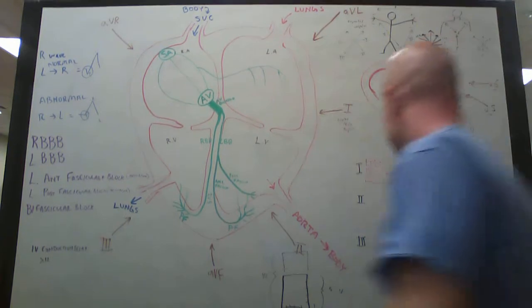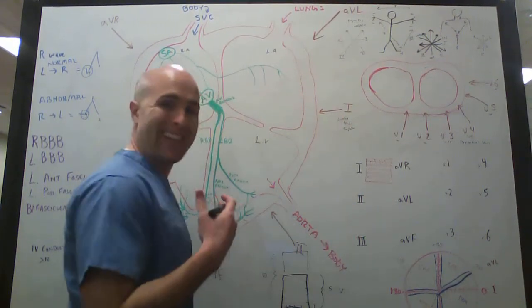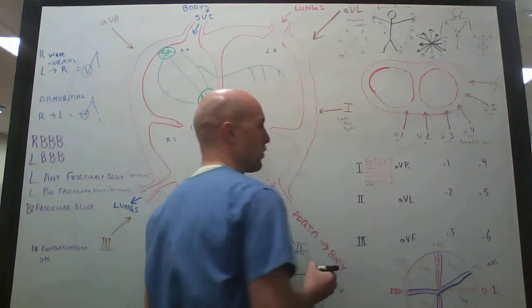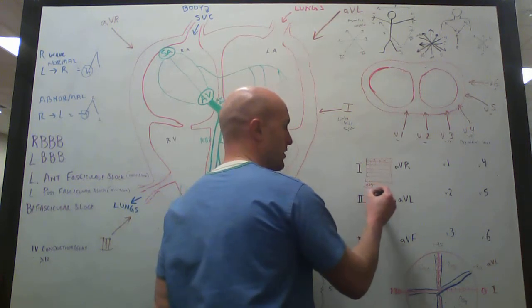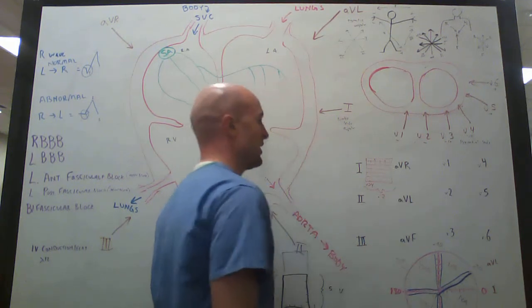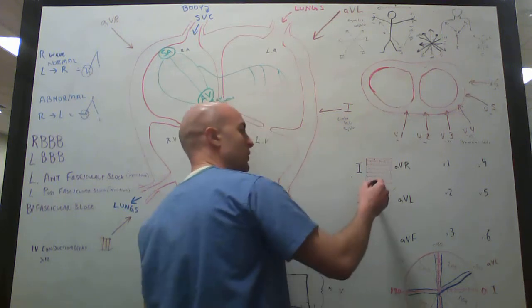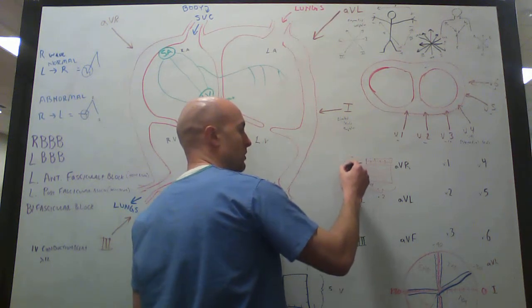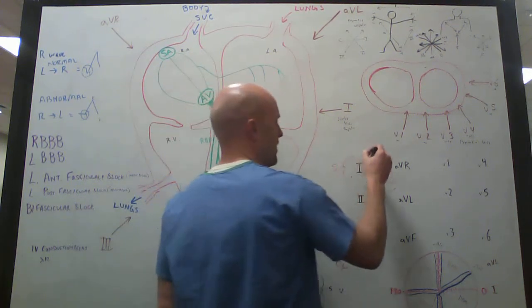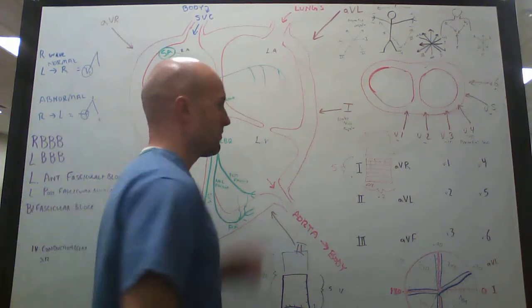So inside the big box you have 5 small boxes, and running along the bottom it's measuring in seconds. Each small box is going to be 0.04 seconds, and then 5 of those comprise 0.2 seconds. Now on the top it's going to be in voltage, and so one little box is going to represent 1, and then we get 5 of those, so the big one represents 5. I might need millivolts, so it might be like 0.1 or whatever. I don't remember.